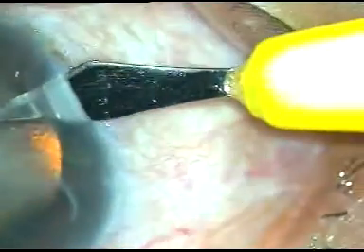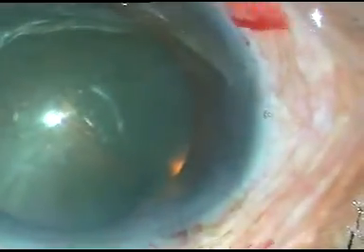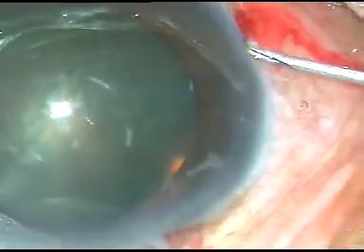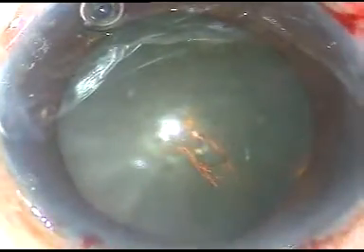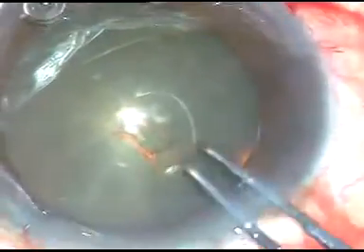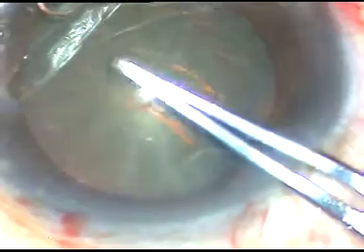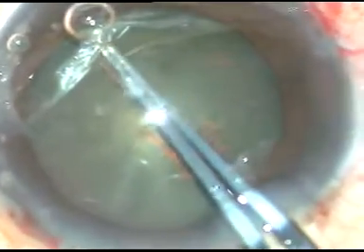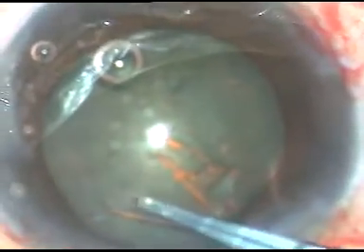A side port incision is made on the right side of the main incision and another side port is made on the left side of the main incision. Now capsulorhexis is to be done. I take a 26-gauge bent cystitome. I incise the anterior capsule and raise a capsular tag. I hold this capsular tag with the Utrata forceps, make an anti-clockwise move, and try to remain at equal distance from the margin of the dilated pupil, thus managing to get a fairly round capsulorhexis.